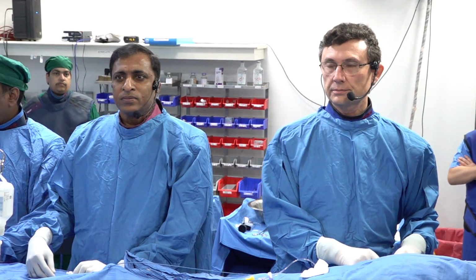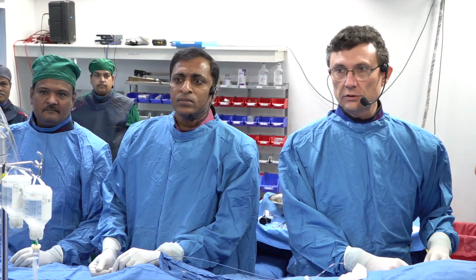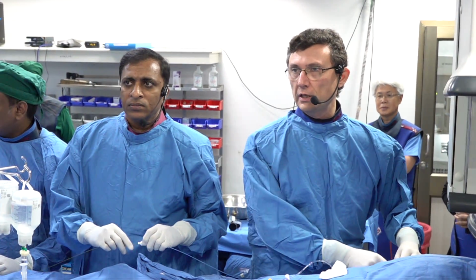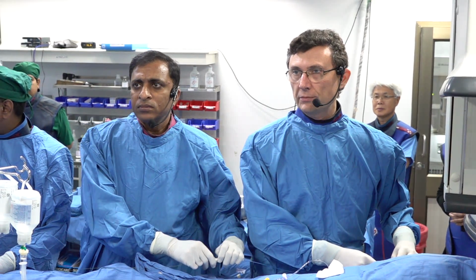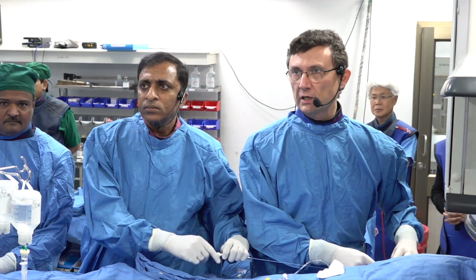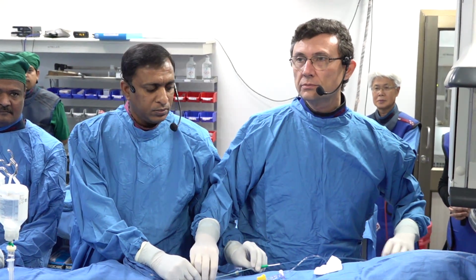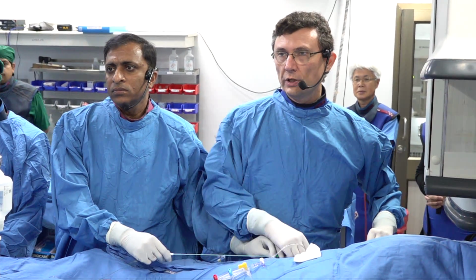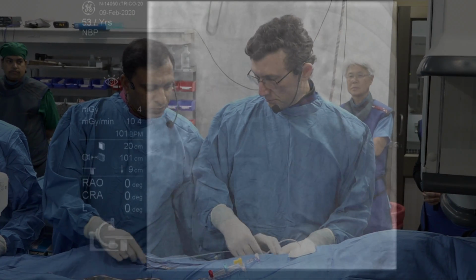All right, we haven't seen the fluoro images or the angio. Oh, you haven't seen? So it's a two-vessel. So there's a little bit of complexity to the LAD, and then there's a simple lesion in the circumflex. The LAD and the circ have separate ostia. So we'll have to see how we engage, maybe we're engaged already.